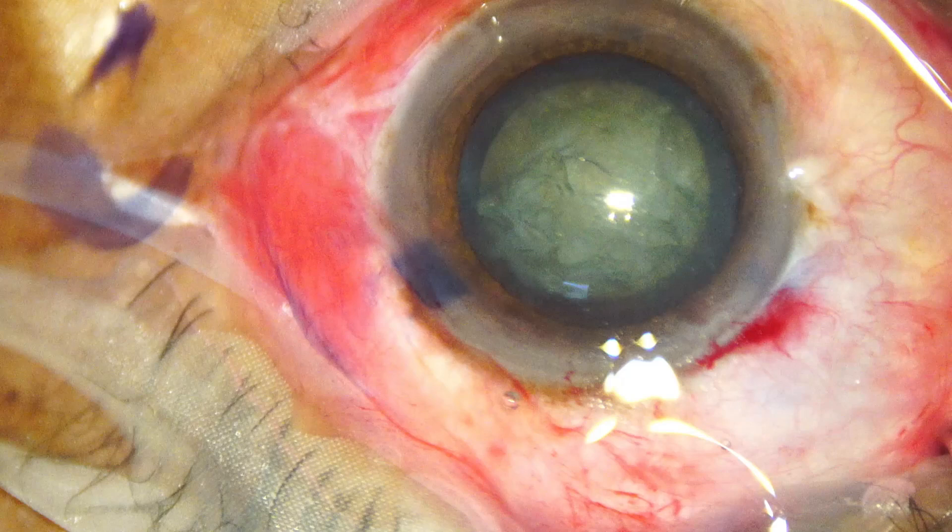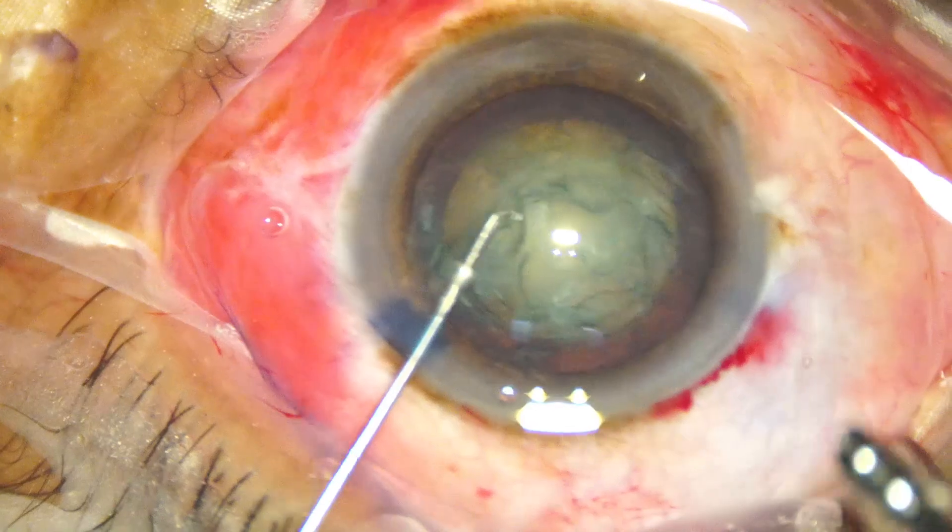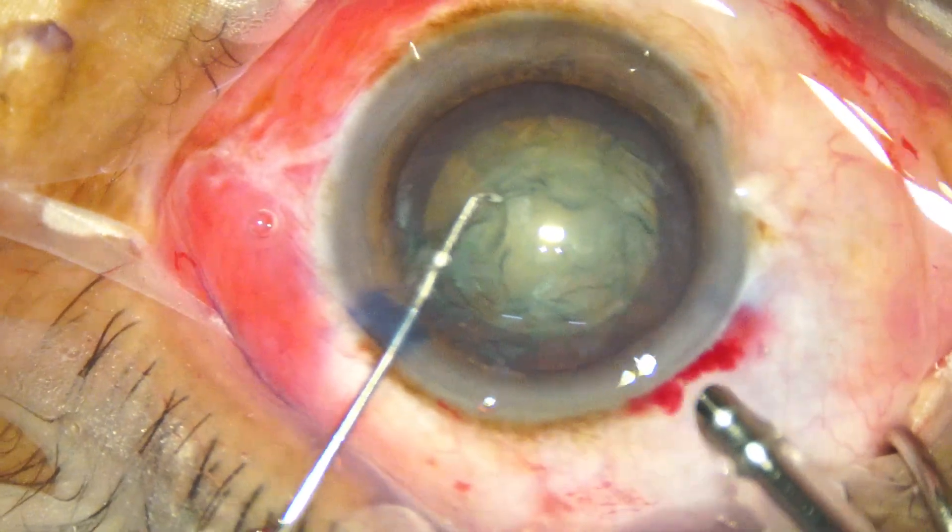Welcome to my workplace at Ranak Heart, West Bengal, India. Let us observe direct chop by my fellow Dr. Pai Chanda Maugh.